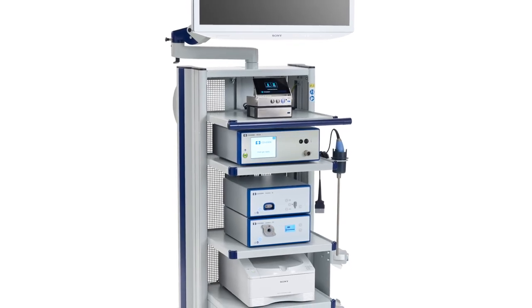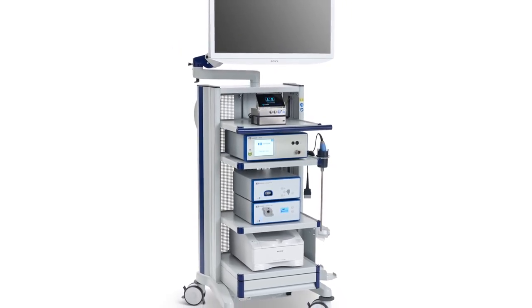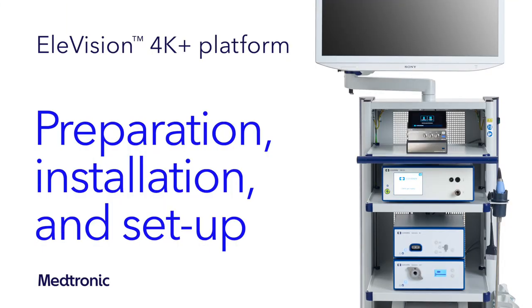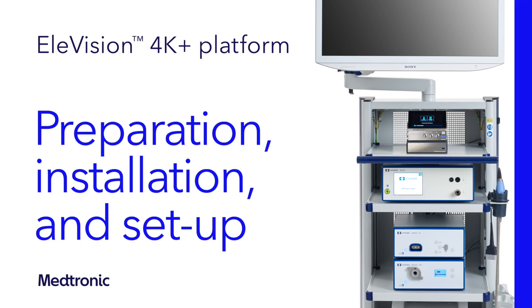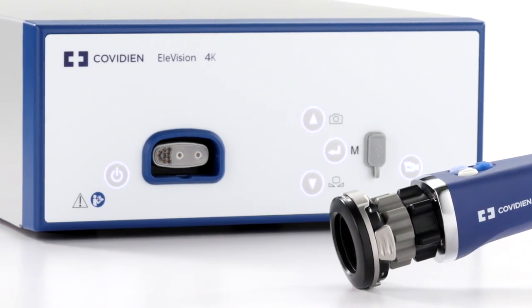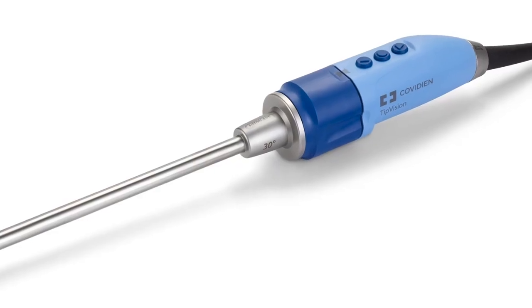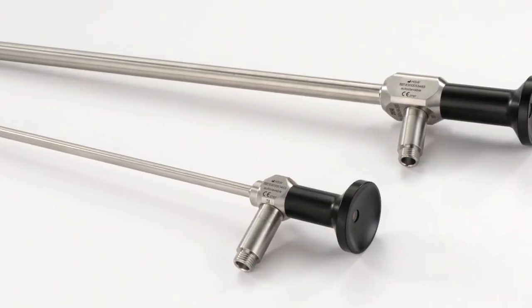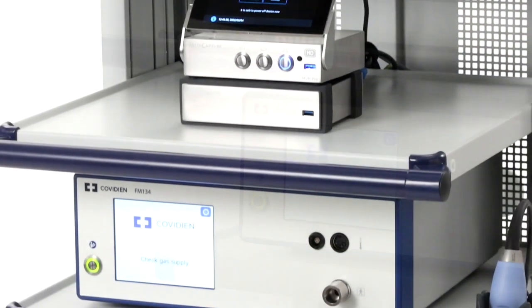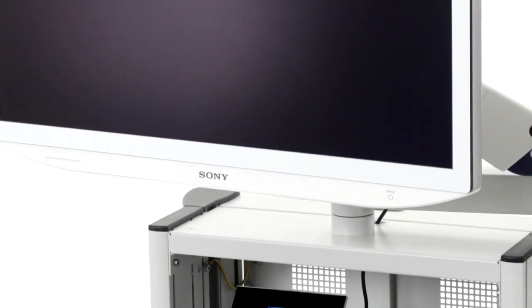Now that you're familiar with the components that make up the Elevision 4K Plus platform, I'll walk you through everything you need to know for installation and setup. Prior to setting up your Elevision 4K Plus platform and performing the initial operation and function checks, make sure you've thoroughly reviewed the instructions for use for each system component and have them easily available for reference. Making sure you properly install and set up your system is crucial.